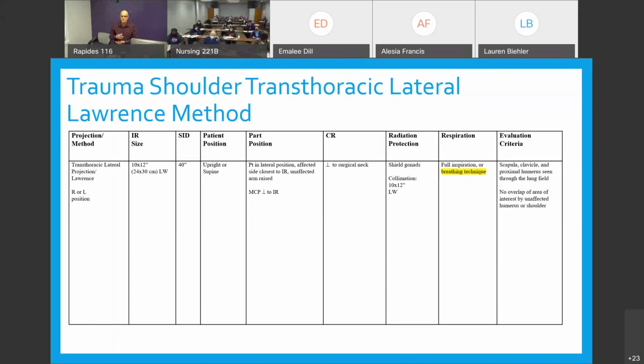Okay, so if a person comes in like this, sling, whatever, we can certainly get one of the proximal humerus, put their back against the board and shoot this. How are we going to get the other one that's 90 degrees from it? We can't really, we can get this one, but we can't do anything else. So if we turn this way with the affected arm against the bucket, raise this arm up, shoot through the thorax, we'll get this one.